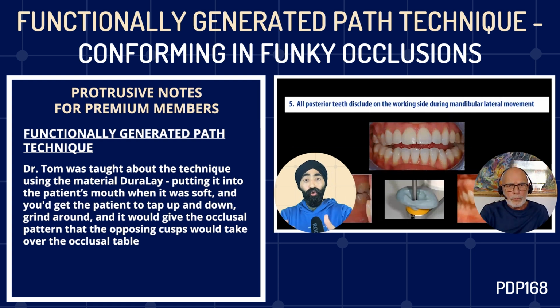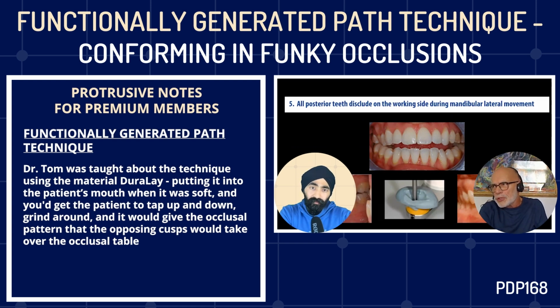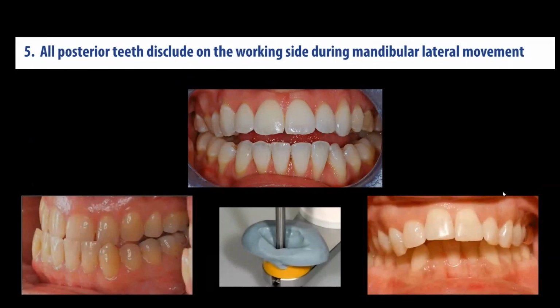What kind of occlusions, therefore, do you think we need to adopt such techniques whereby we need to give the technician more clues or more information to help them to actually make sure you're not spending hours adjusting in the chair?